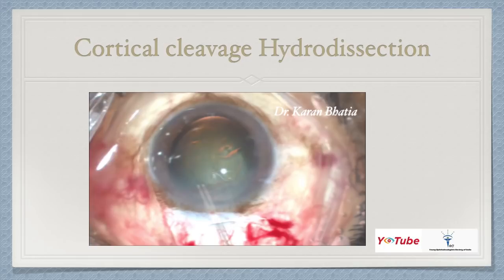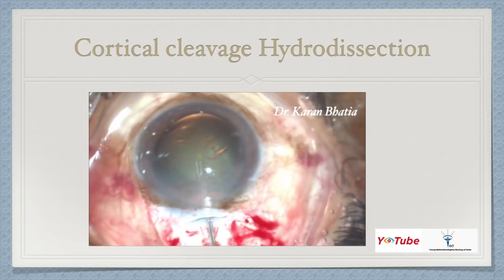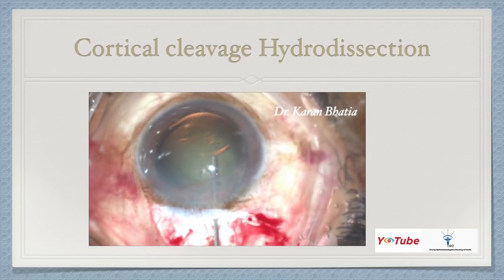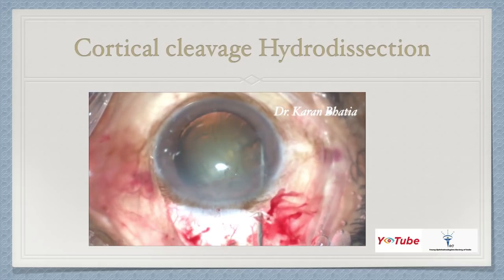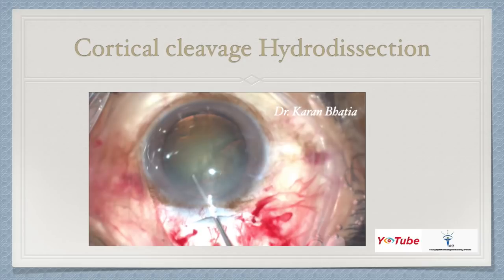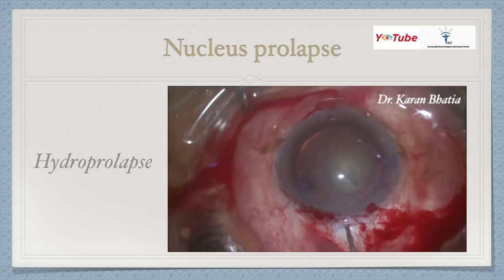The next step is cortical cleavage hydrodissection. This is very important because a good hydrodissection brings out the equatorial cells, reduces the amount of irrigation-aspiration needed, and allows the nucleus to come out very nicely. In the slow-motion video, you first remove a little viscoelastic, then go underneath the anterior capsule, inject fluid towards the equator, and see the fluid wave. Then tap the center of the lens and repeat on the other side. I generally perform multi-quadrant hydrodissection in all my cases.